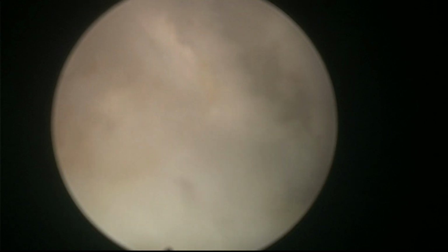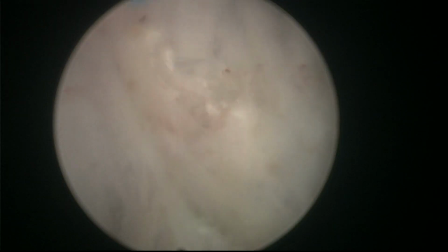because you know more or less where you are, you know the shape of the capsule, and you're just progressing. Sometimes the tissue gets in the way, you don't see exactly what's happening over there, you see like now, but you know that you are doing a movement that is totally safe, because we are following the circumference of the prostate, and it looks safe. Here you see the plane is not extremely beautiful, but it's developing very nicely.